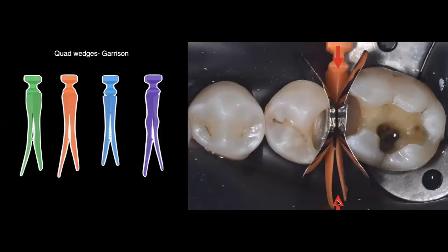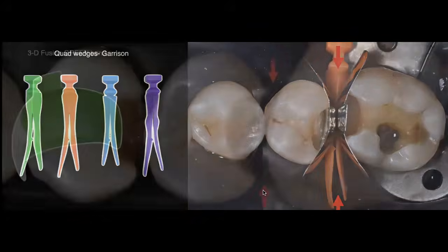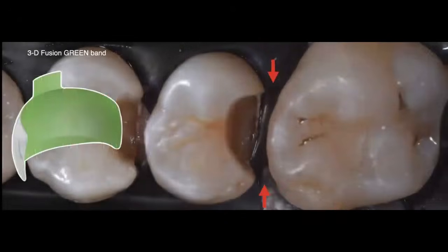Now, what I like about these wedges is this split system here. I think it was ingenious by the person that invented this. You can see that he split the wedges in half so that now when you place the ring, half of the wedge goes mesial, the other half goes distal, and helps with adaptation of the band so that you have an ideal lingual embrasure. So keep that in mind. That's one of the things that I like about the system, and that's one of the things that the wedges do for you. Now you can see here that this is a different case.